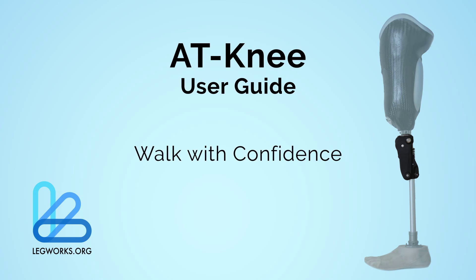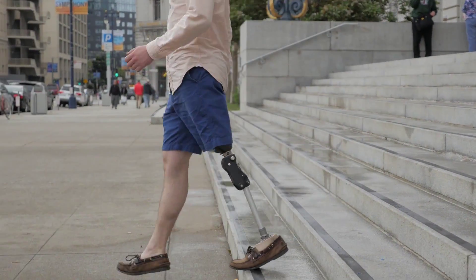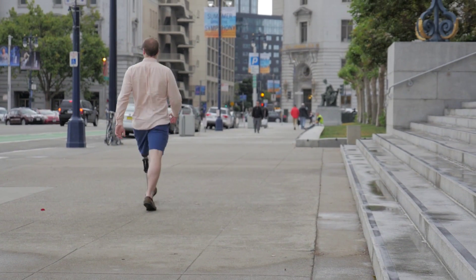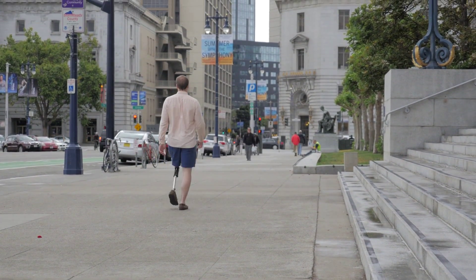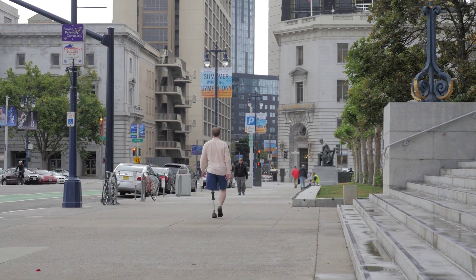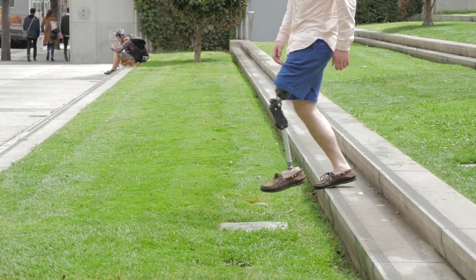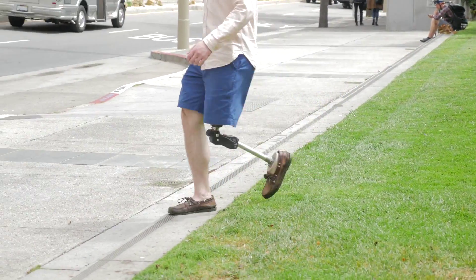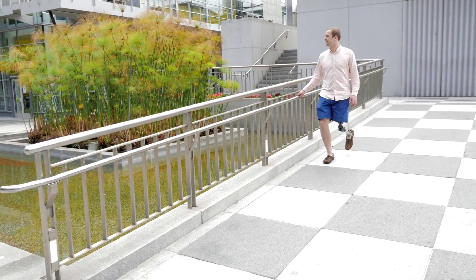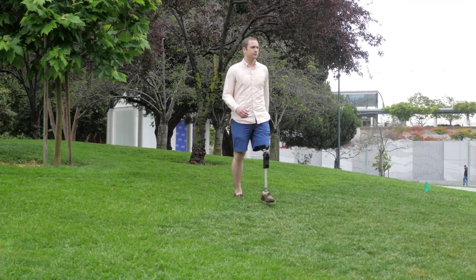Walk with confidence on the AT-Knee. The automatic stance phase lock encourages the amputee to have an even and smooth gait pattern. The ASPL mechanism locks upon extension and is stable all throughout stance phase until toe-off. The knee will only release when the user has their weight on the toe and is ready to take the next step. Be sure to use an assistive device as needed until you have confidence in your stability and walking with the AT-Knee.